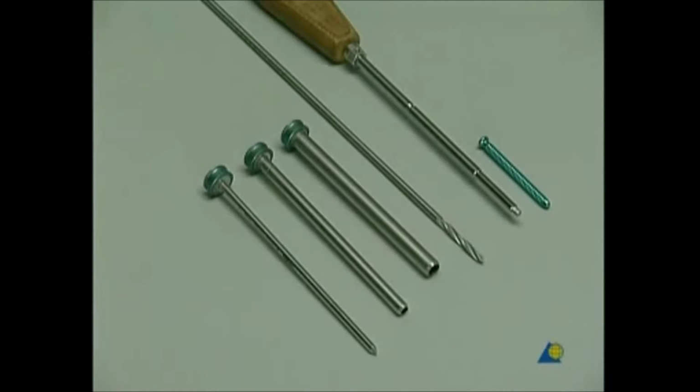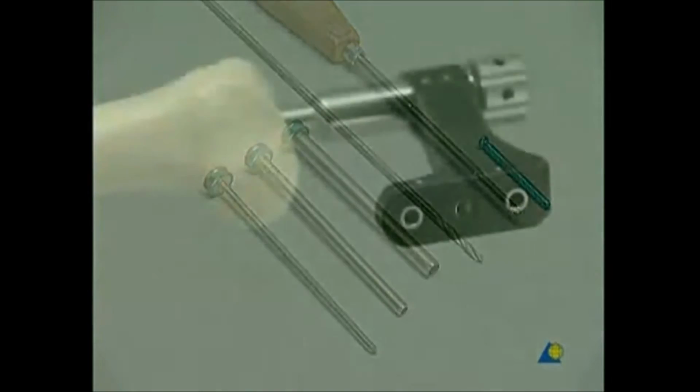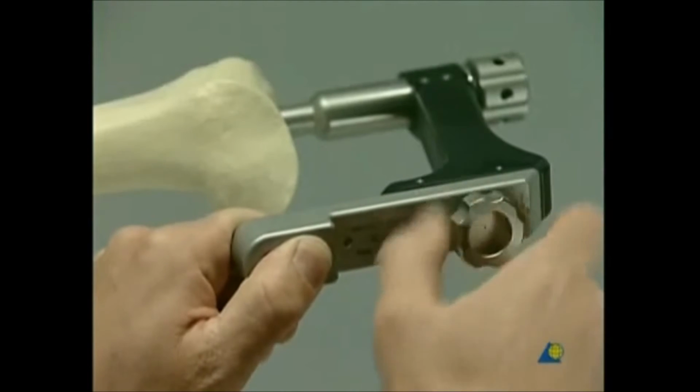For the insertion of the 6 millimeter locking screw, the turquoise triple trocar assembly is needed. It consists of the 4.9 millimeter trocar, the 8.0 4.9 drill sleeve, and the 11.0 8.0 protection sleeve. Also the 4.9 millimeter calibrated drill bit, the hexagonal screwdriver, and the 6 millimeter locking screw of the appropriate length. Now the aiming arm is mounted onto the insertion handle.